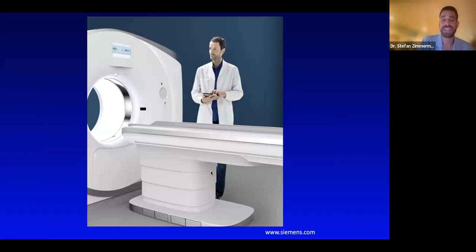Here's what the thing looks like. Again, it looks a lot like the PET CT. It's just this sort of donut shaped thing. And you lie down on this board and you go in and it takes pictures.